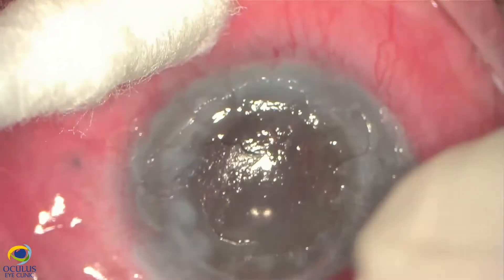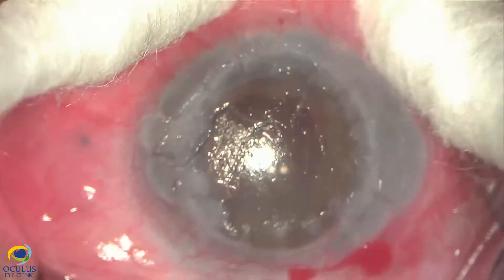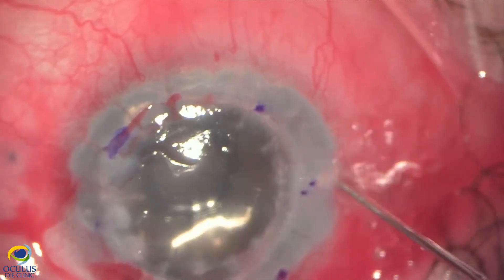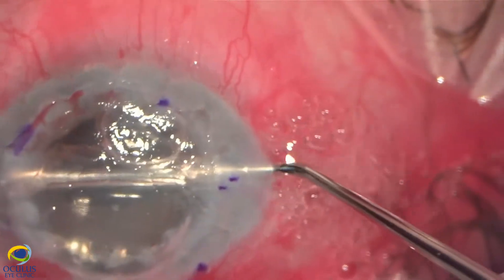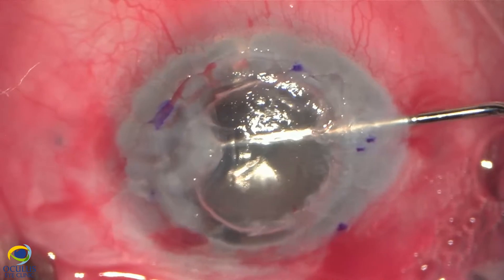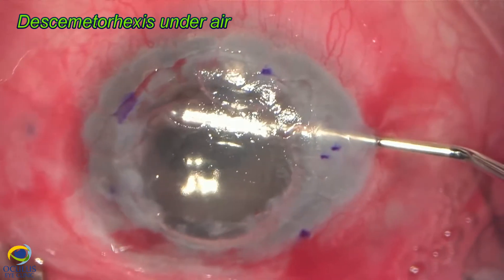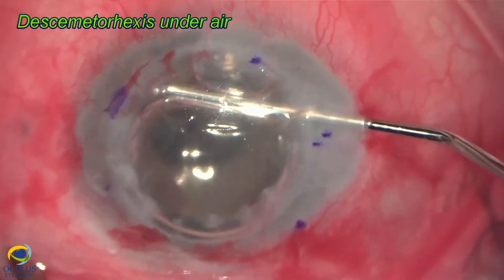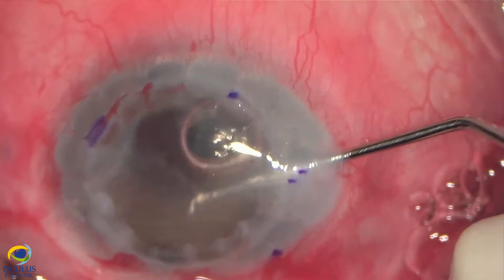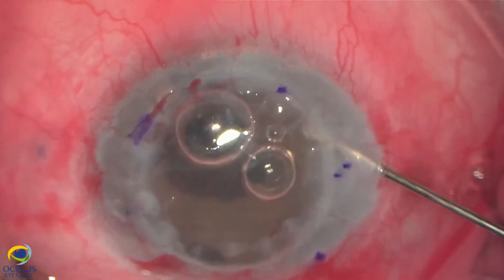We removed the epithelium and injected air in the anterior chamber in order to perform the descemetorhexis with a reverse Sinskey hook under air. You can notice here in the nasal part of the graft-host junction there is a spur of the graft which has a tendency to detach from the previous wound, so we need to be very careful with the descemetorhexis in that area.